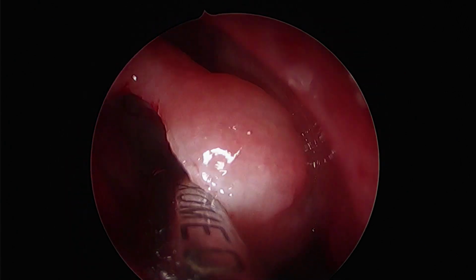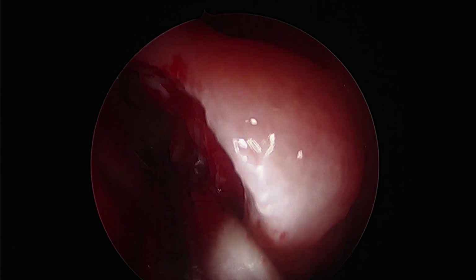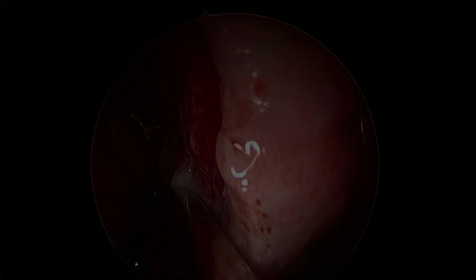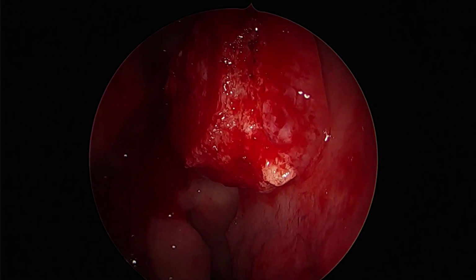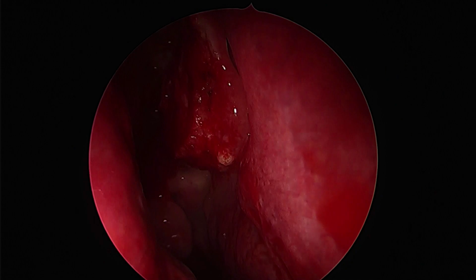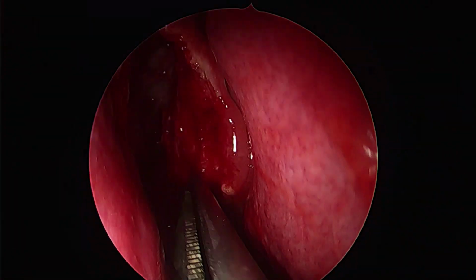A point to note is that in case you intend to preserve the middle turbinate or even excise it, one mustn't really do this step very high up towards the axilla, because that can make the middle turbinate floppy and later on lateralized, thus occluding your frontal recess. We have gained some space by debriding the lateral aspect of the middle turbinate.